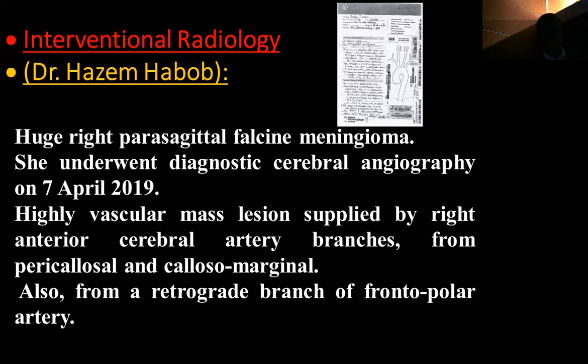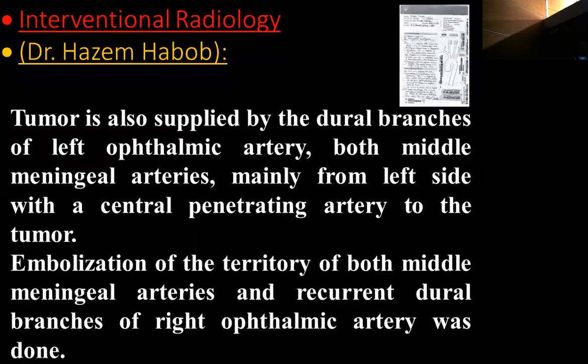Dural branches come not only from external carotid arteries, but they come as well from internal carotid arteries. There are a lot of pathways for dural supply from the internal. So it was highly vascular, supplied mainly by dural branches from the frontoparietal and pericallosal branches of the anterior cerebral artery, and from the callosomarginal as well. And usually there are anastomotic dural branches coming from the anterior frontal and from the pericallosal artery. Even there was a supply from the ophthalmic artery and from the frontopolar artery.